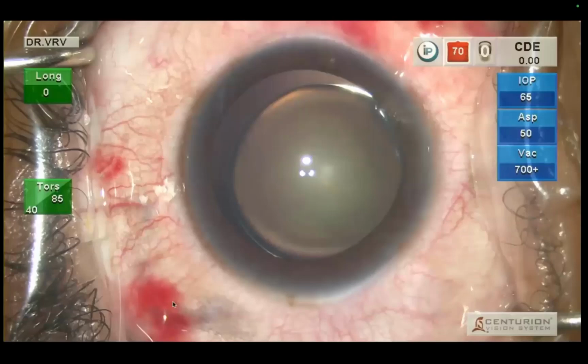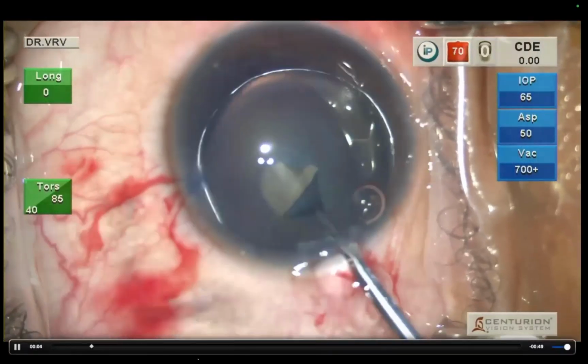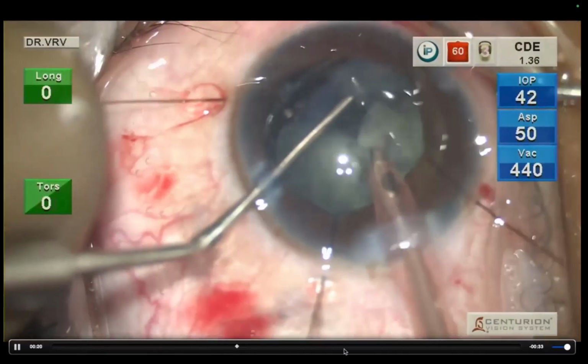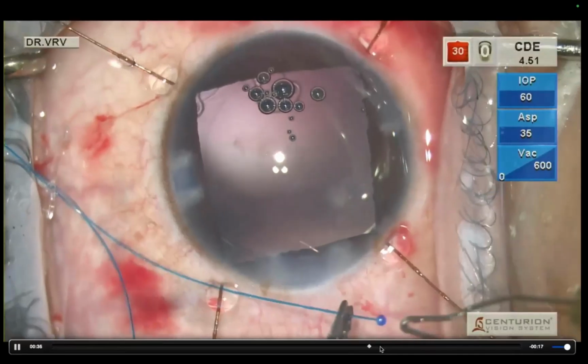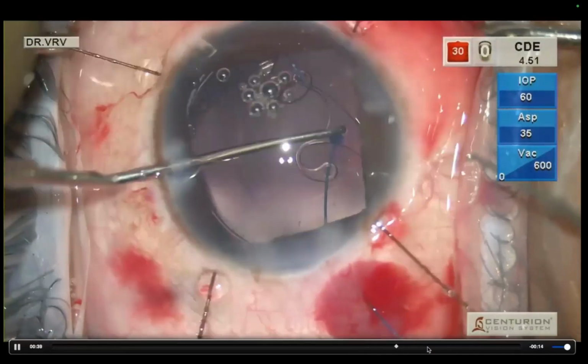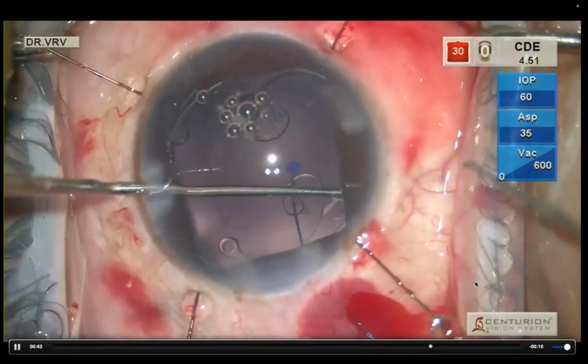There's one case where I could do it on a microspherophakia patient where 2 CTS were placed. But unfortunately, when I tried to do the same on the other eye of the patient, I caught the capsule and so I had to do an SFIOL. So this is also possible.